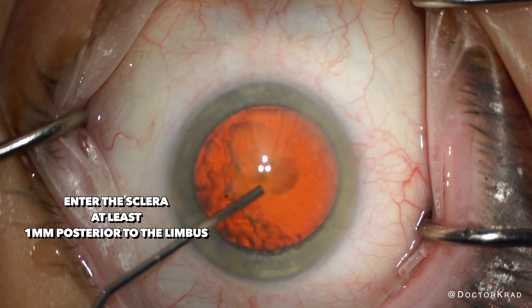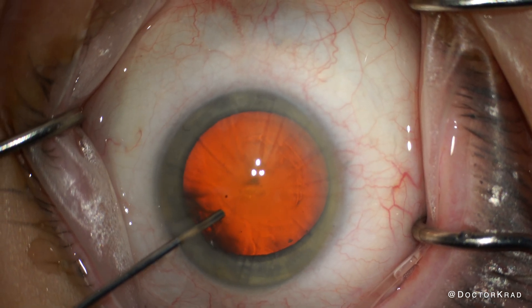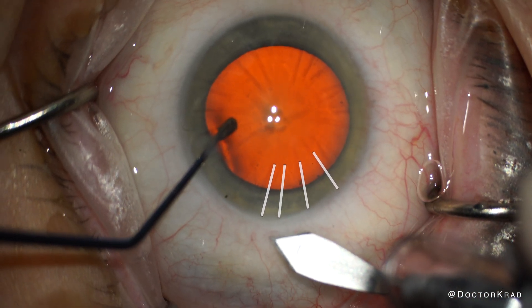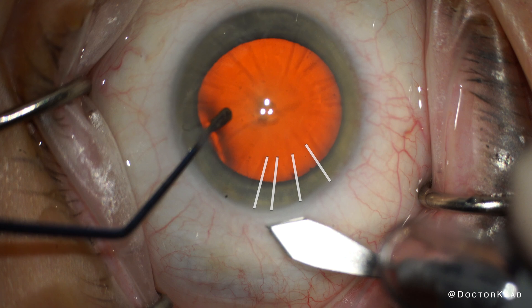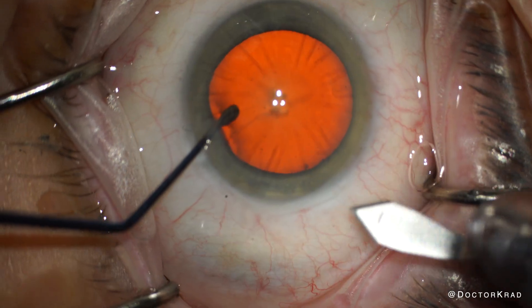There are different approaches to creating a scleral tunnel. Some perform a large conjunctival peritomy with scissors, but I simply make a groove through the conjunctiva and partially through the sclera. Here I make two passes at the groove because I don't think my first one is deep enough. If the scleral tunnel is too superficial, it won't be effective.